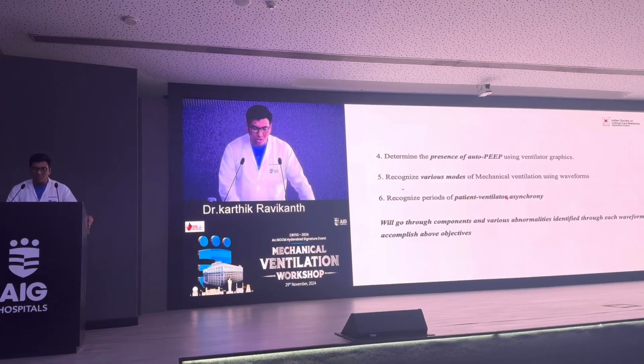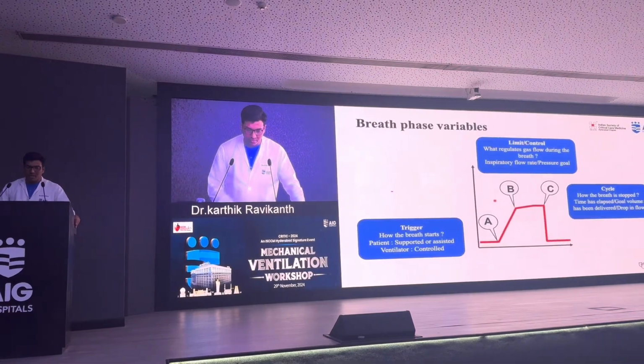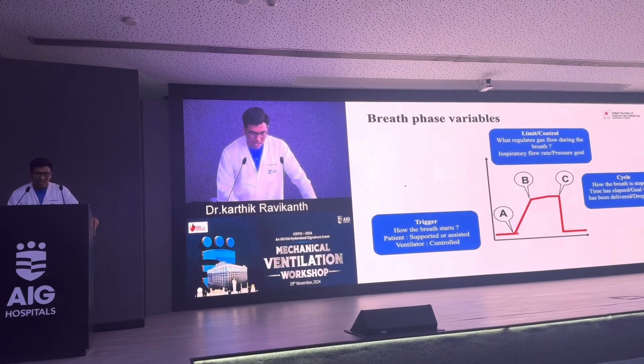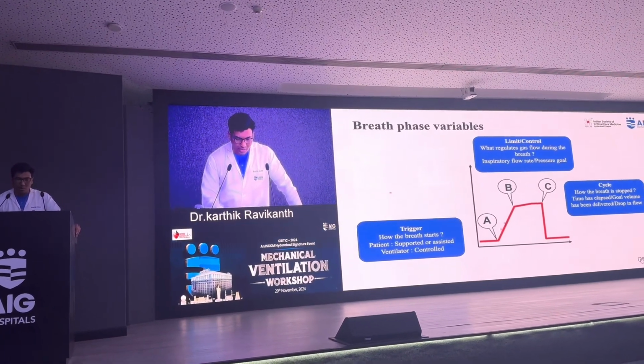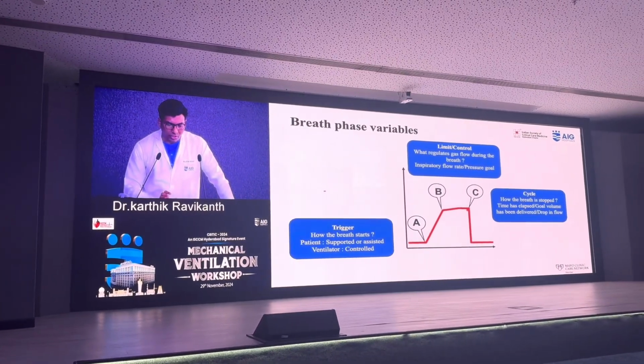And the most common abnormalities identified through each waveform to accomplish the above objectives. So starting with, as discussed by the previous speakers, you have to understand there are 3 most important breath phase variables. What triggers a breath, what regulates a breath, and what cycles a breath?